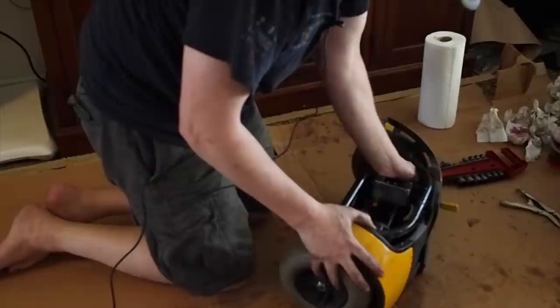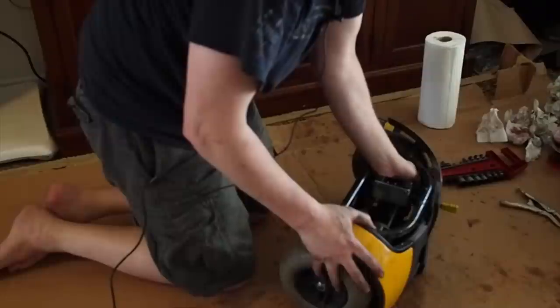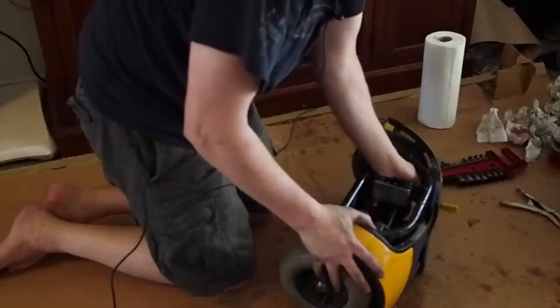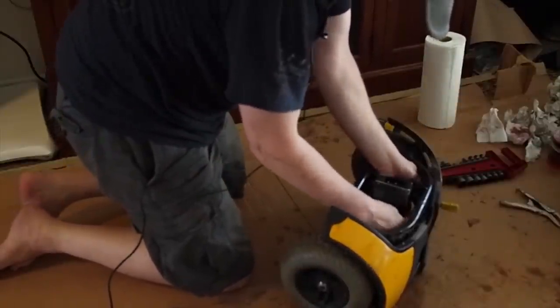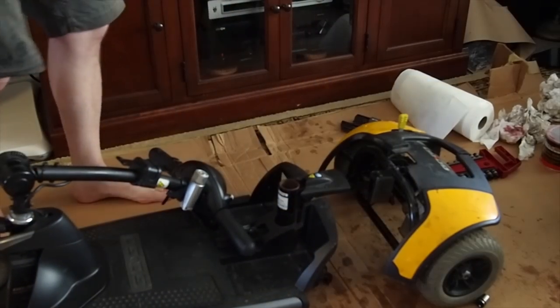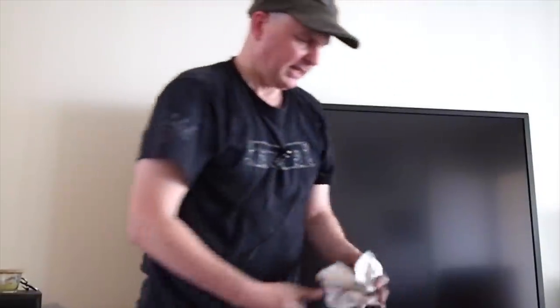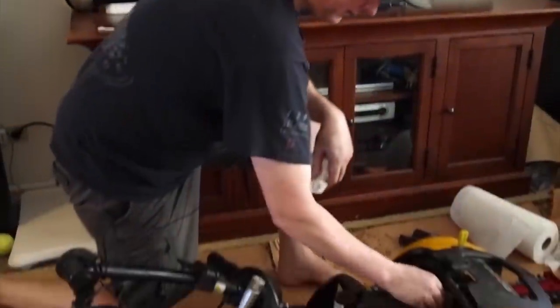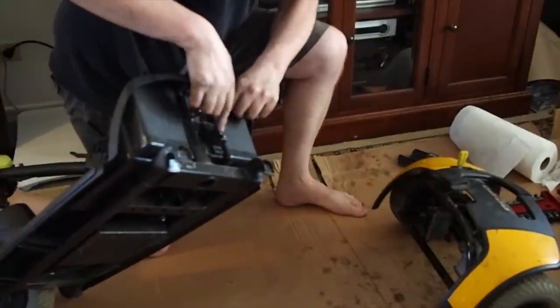As soon as they're in, then we can start assembling the scooter again and see if my fix was a fix or not. All right, so I'm very sweaty because it's hot here, and we don't have air conditioning, so pardon my dripping. But here's where this is kind of loose. Here's where I need to get that connector to match up with this.